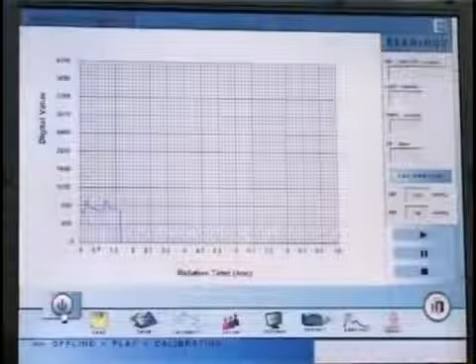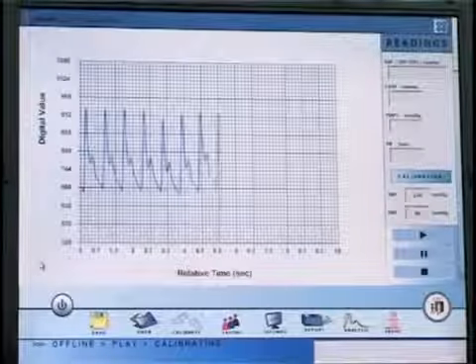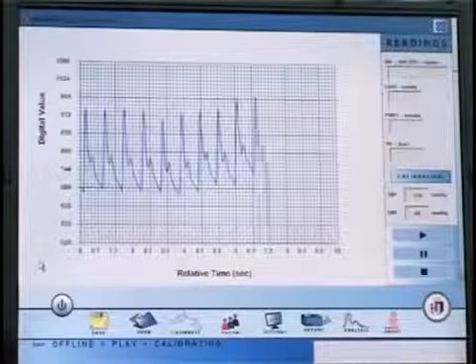Now, when we did that invasive method using a protocol written by Professor Brian Williams, he used a catheter and put it at the root of the aorta, and we put the B-Pro on the hand of the patient undergoing angiogram. And for every wave, we continuously follow wave for wave.